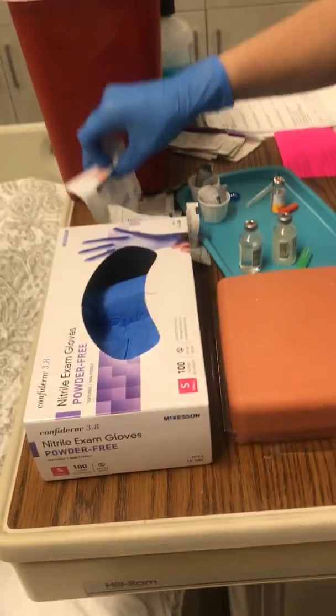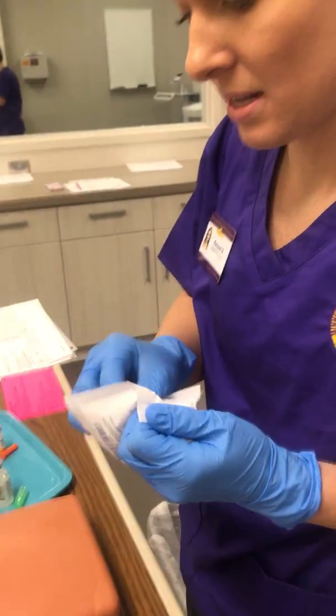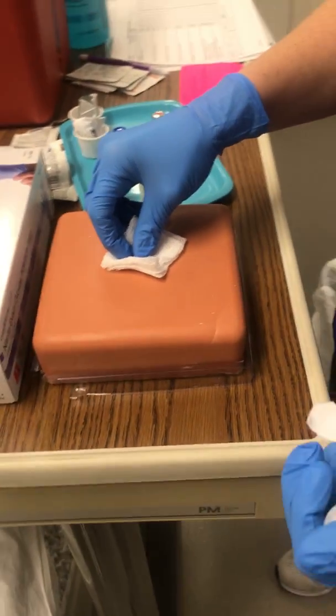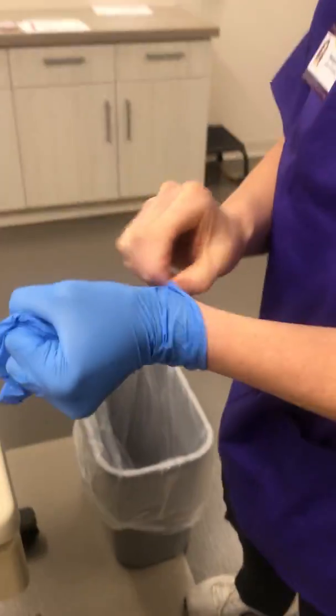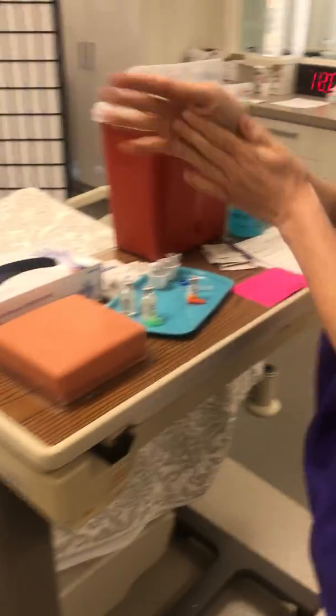And they weren't bleeding on the deltoid one at all, but this one they're not really either, but we can apply the gauze on there if necessary or needed. They didn't need it on the deltoid, like I said, but if they did, we could. Just light pressure on that one. So then I'm going to take my gloves off. I'm going to wash my hands.